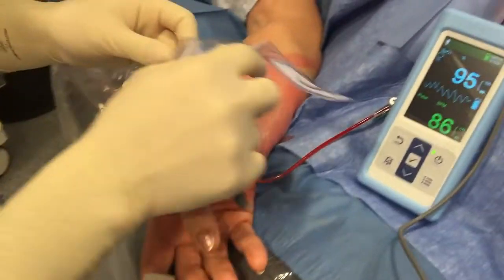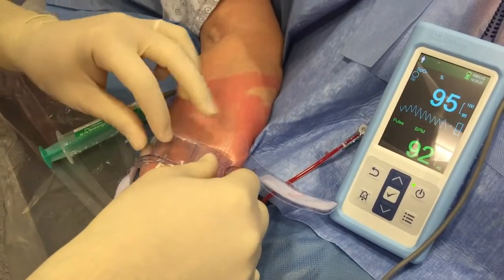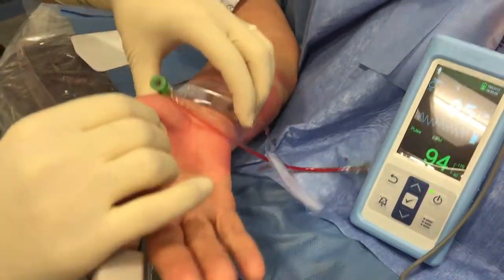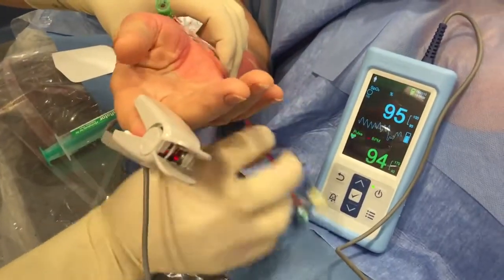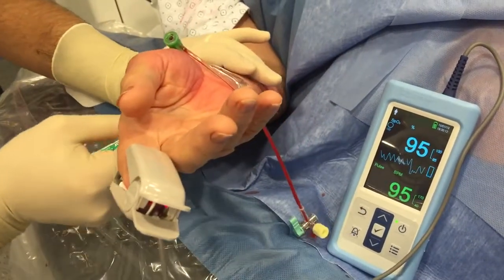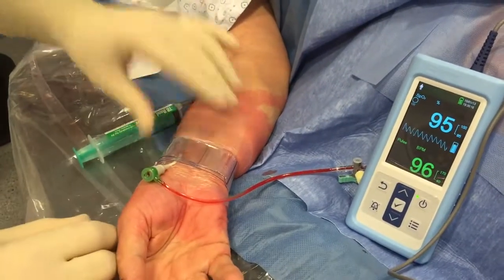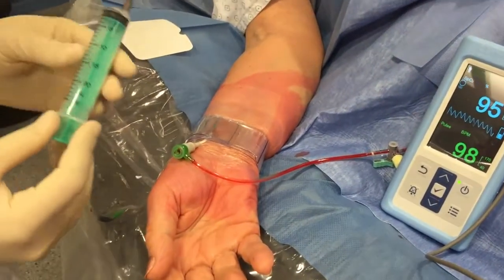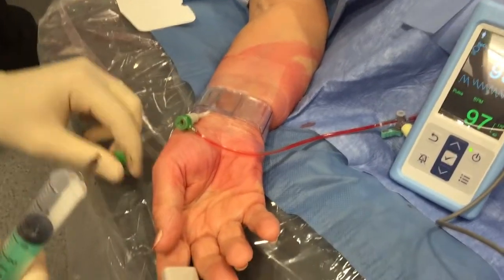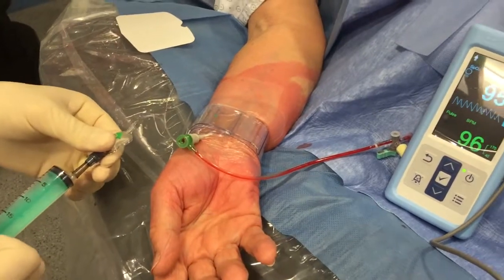First of all, as usual, you place the TR band on average one centimeter above the puncture site, as you can see here, and we first inflate the TR band with 12cc of air, as shown here. It could be less — it depends from hospital to hospital.